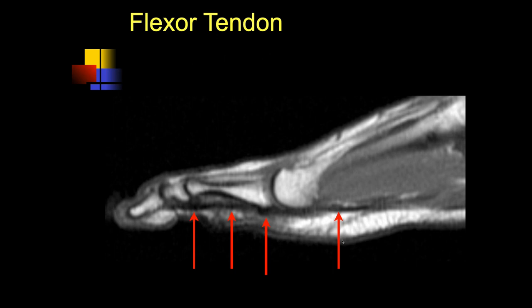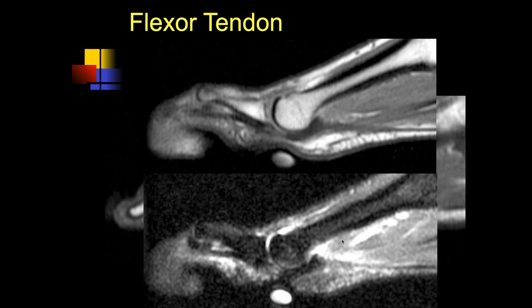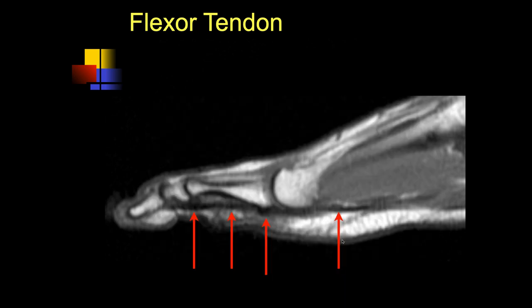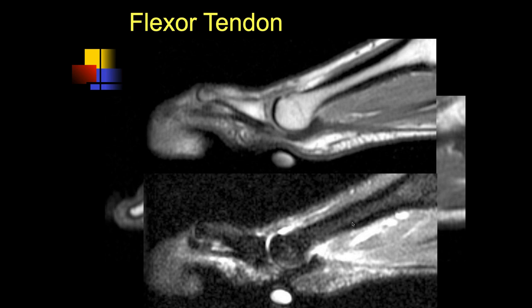This is a patient who had pain on the plantar aspect of the first digit. Looking at the flexor tendon, there's increased signal at the skin marker and there might be a plantar plate injury. This actually was a tear — you can see a little proximal retraction. The plantar plate was torn here and retracted back a little bit.